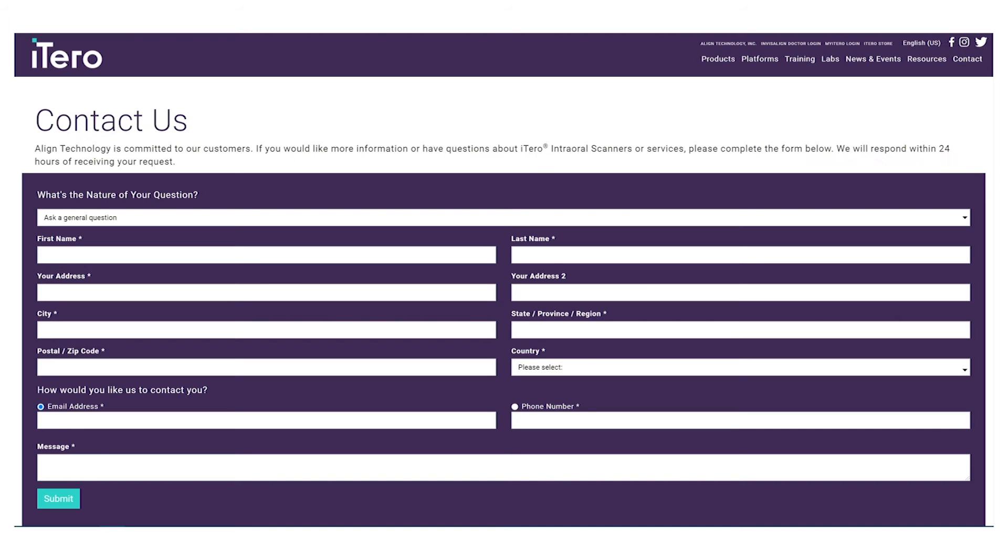To access the orthodontic module, you will need to sign up for a subscription or create a fee per case agreement with iTero.